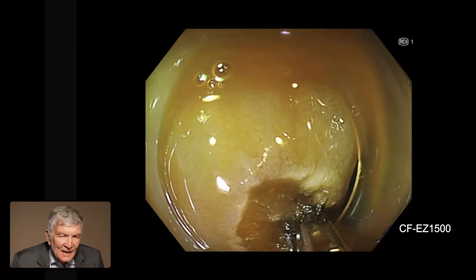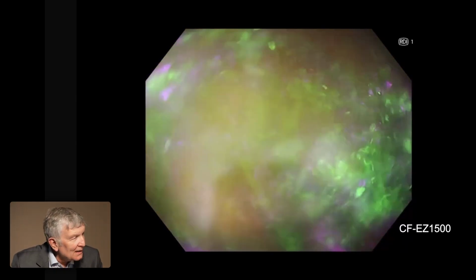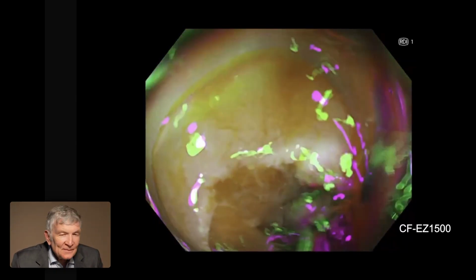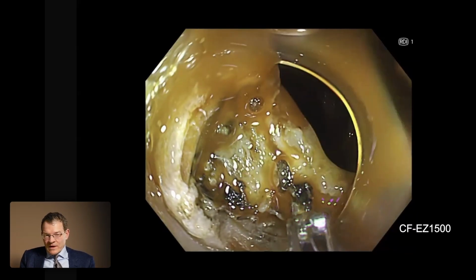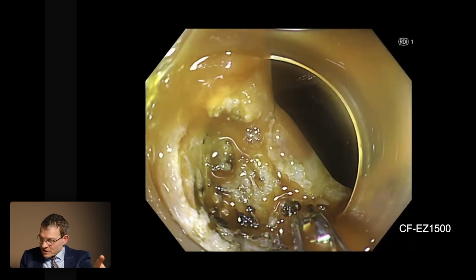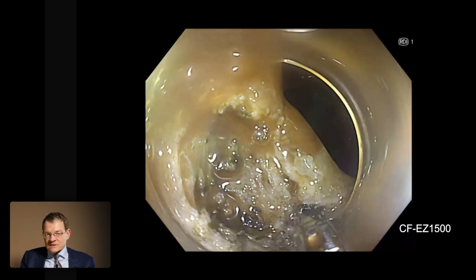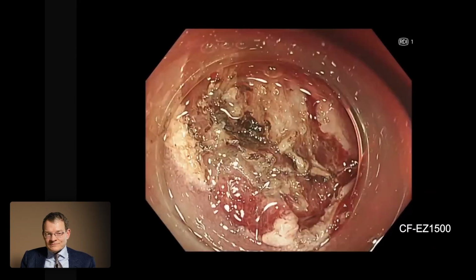Good, yeah, we understand. So the orange helps you to look through the blood in some way, a little bit? Somehow, I think the most important is you have less blood, and for sure where the blood concentration is highest, you have the most orange color, and this is a really great novelty. Okay, that's bleeding. RDI doesn't have any diagnostic aspect? No, I don't think so.